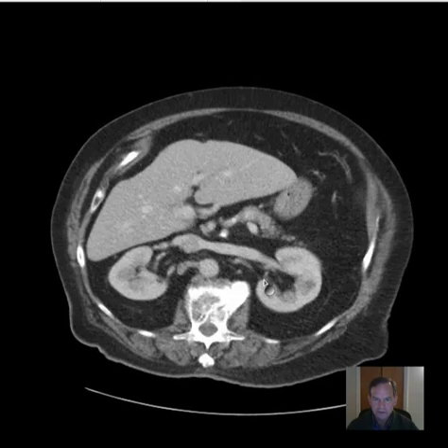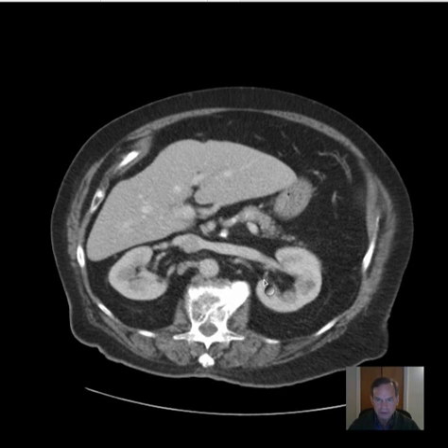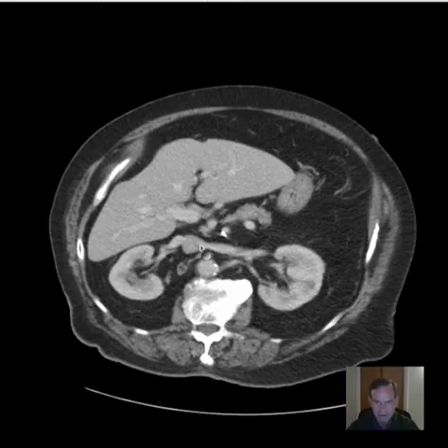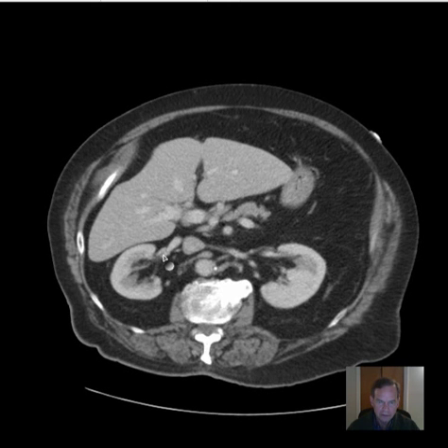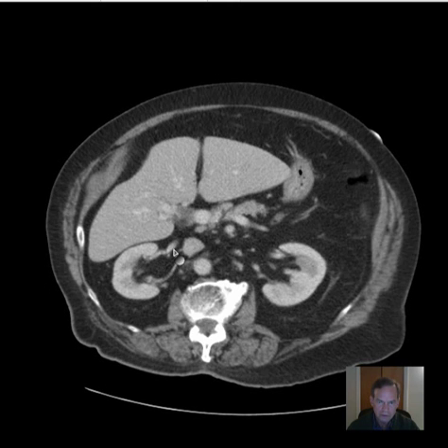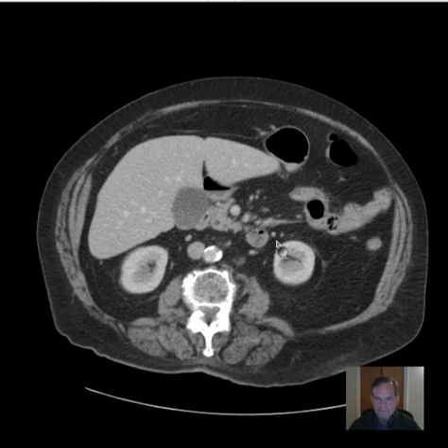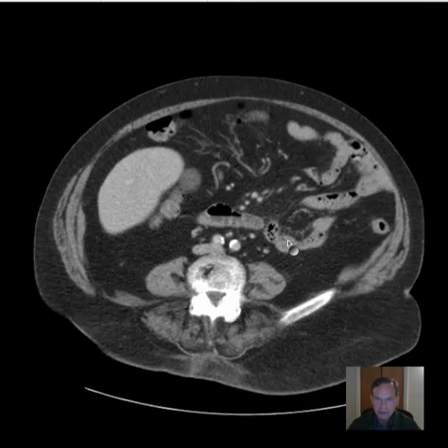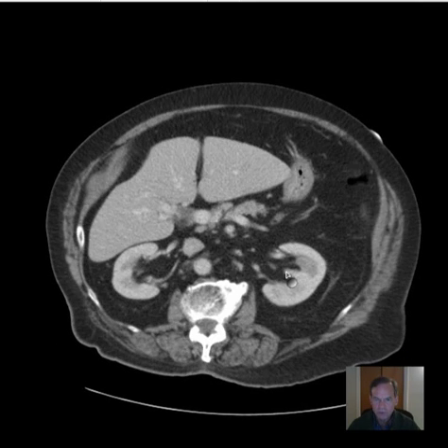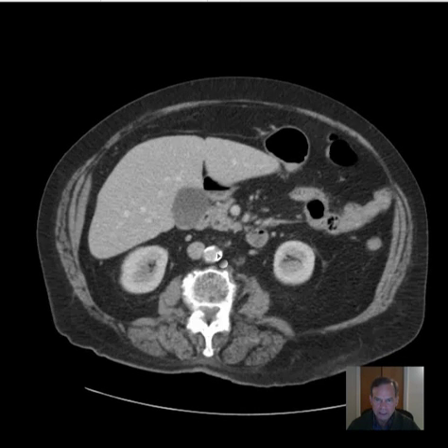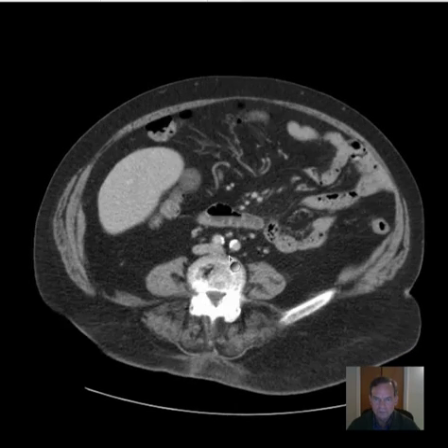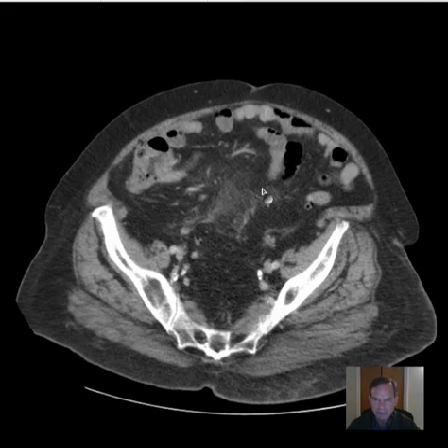The kidneys look fine - I don't see any masses, there's symmetric enhancement of the renal cortex bilaterally. The left renal vein is coming in from the left kidney into the IVC here, and the right renal vein is coming in here, a little less prominent. No sign of obstructive uropathy; collecting systems appear normal. The abdominal aorta appears normal in size, a little tortuous but that occurs with age, particularly with a history of hypertension.